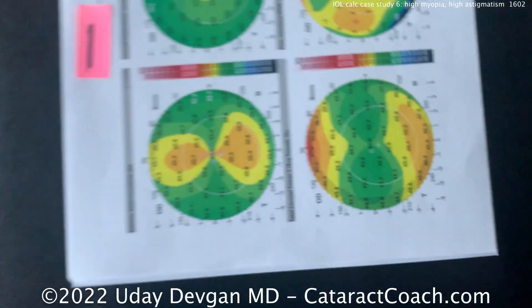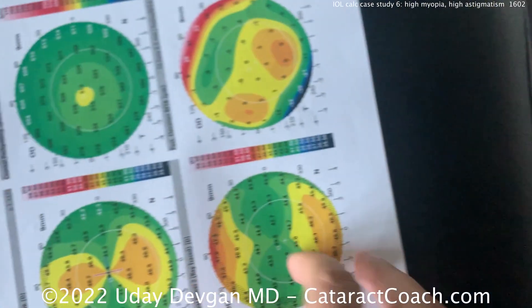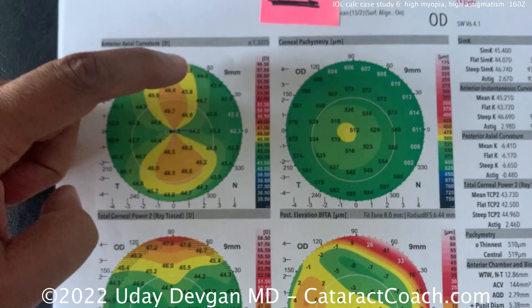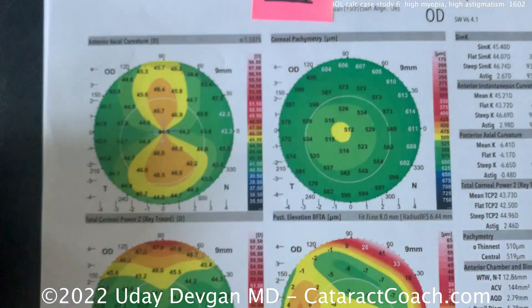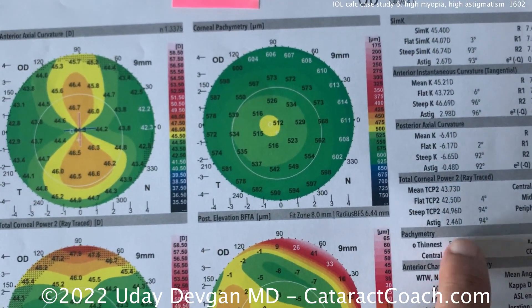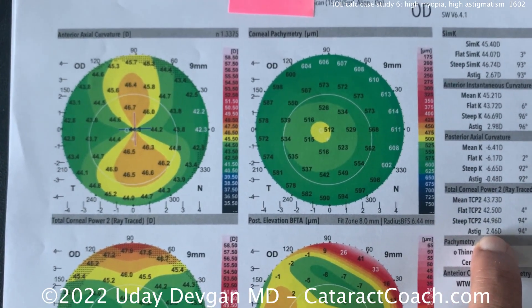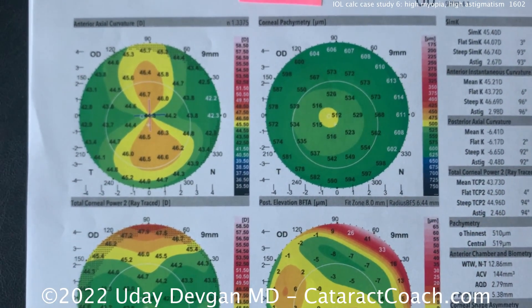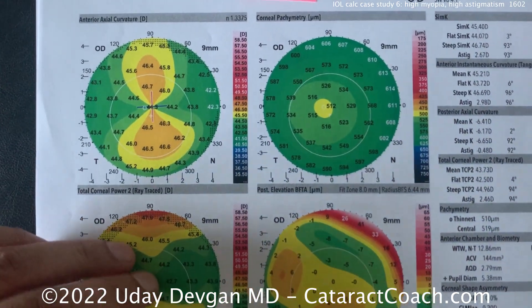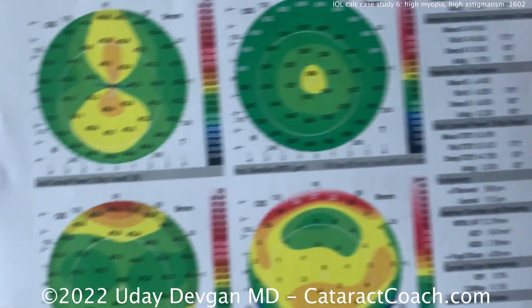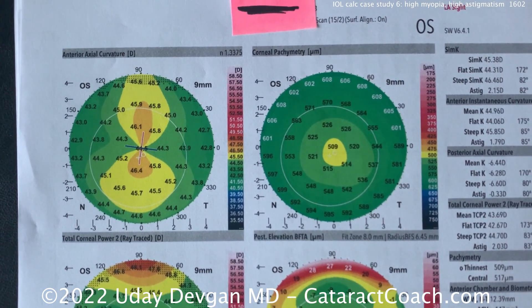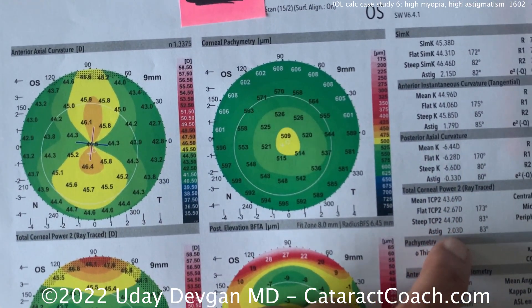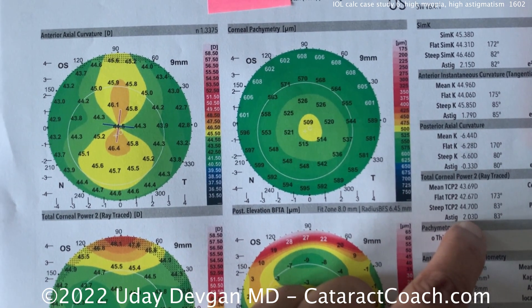Here's the tomography. You can see the right eye — all of that astigmatism reads about 2.5 diopters if you measure anterior and posterior cornea. That's great — consistent. For the left eye, there appears to be a lot more astigmatism apparently, but total anterior and posterior is only about 2 diopters worth.